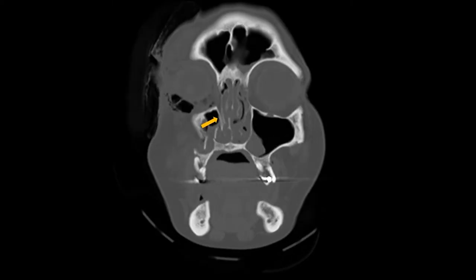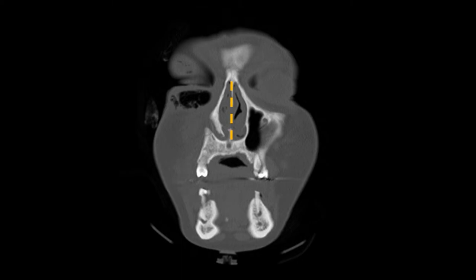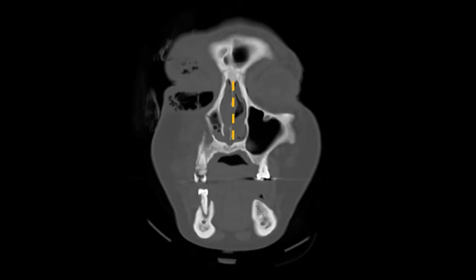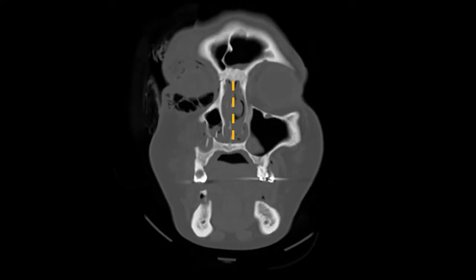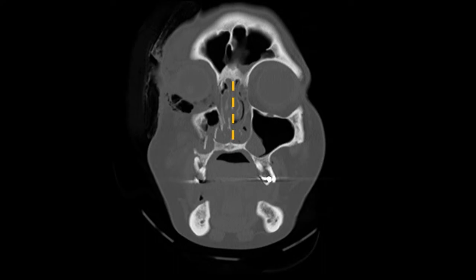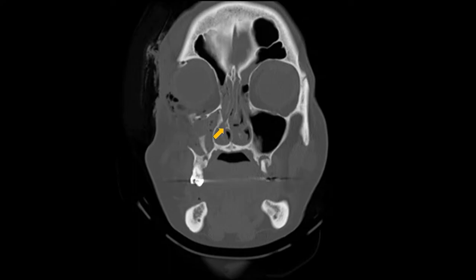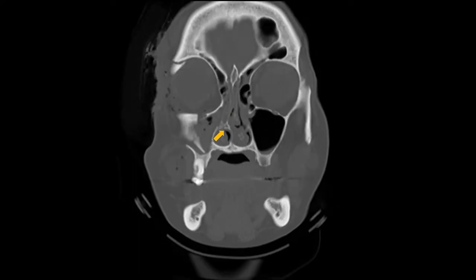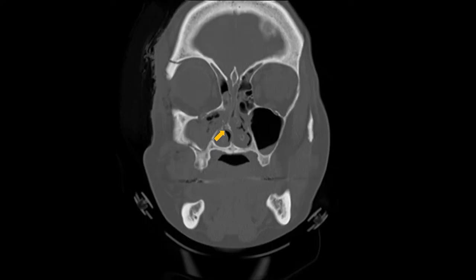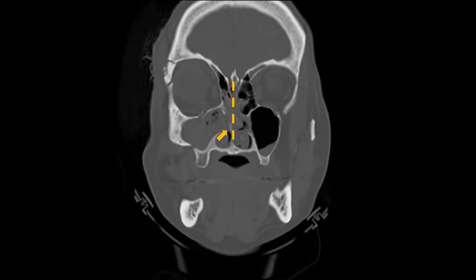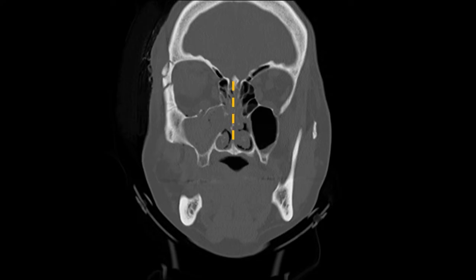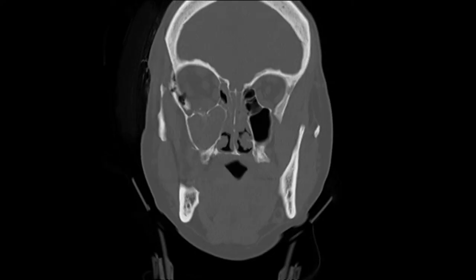Here is another view of the nasolacrimal duct. When I look at the septum, I generally draw a vertically straight line going down the middle. You can see that the septum starts out relatively straight anteriorly. However, about mid-septum, there is a large bony spur that juts out over to the right. This is likely a pre-existing septal spur, and you can actually see that it's touching the lateral nasal wall. This pattern continues until reaching the posterior septum, at which point it straightens back out.